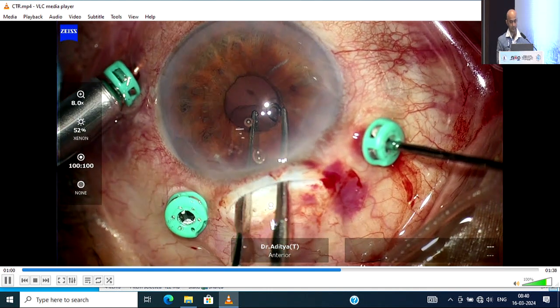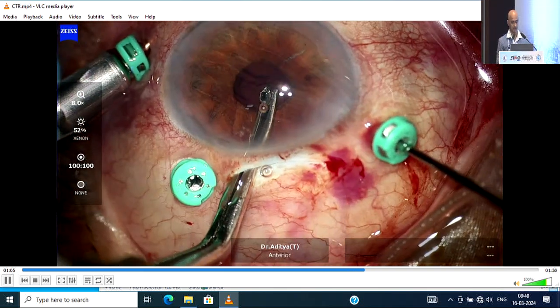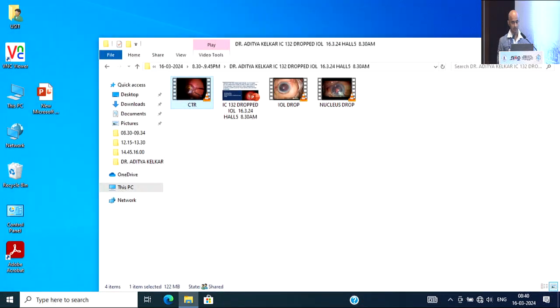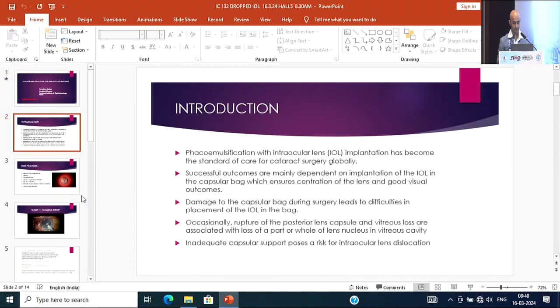So care has to be taken that once you remove the whole bag capsular segment, you make sure that the retina is scanned once again to see that there are no inadvertent remnants inside the vitreous cavity that may surprise you next day post-operatively.